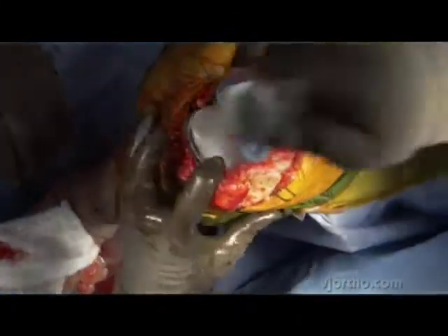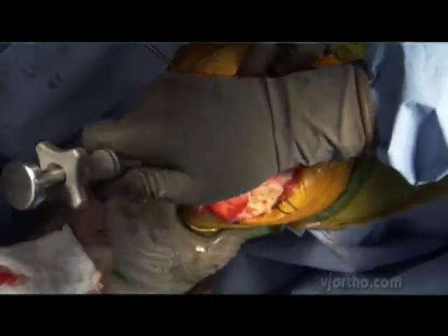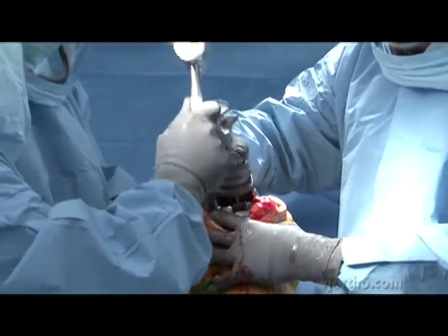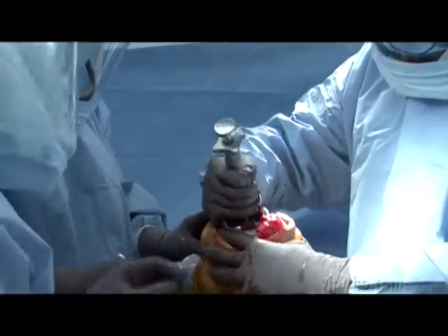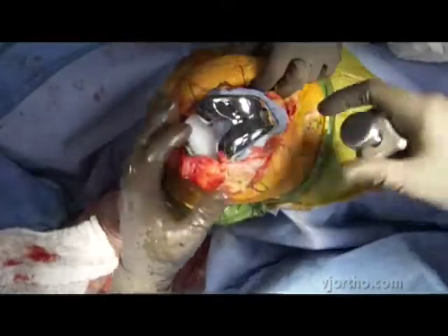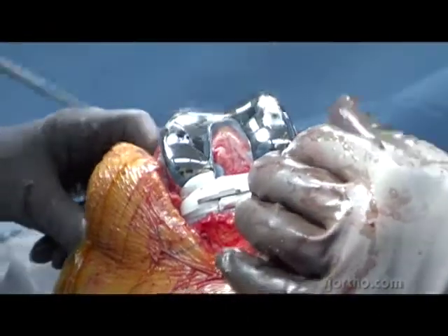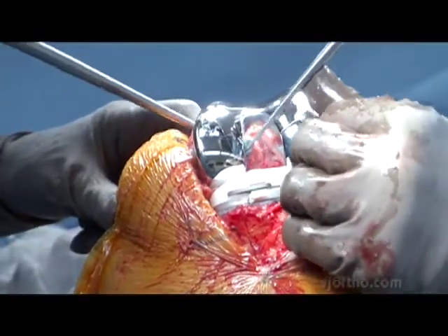Now I've identified the lug holes that we drilled when we got our final femoral component positioning. Sort the lugs into those holes and seat the implant. You can see this is a small woman — no overhang medially or laterally. It's an off-the-shelf system, but it's about as close to a custom system as we can come.